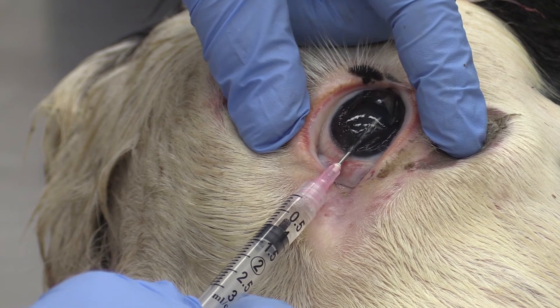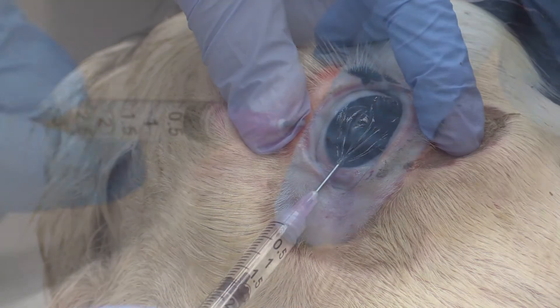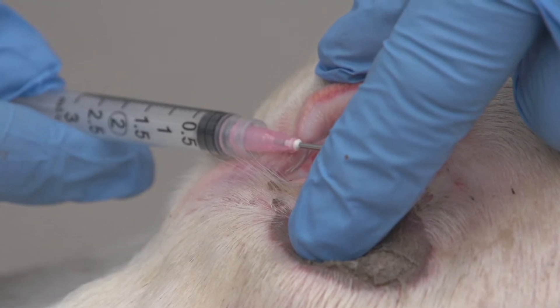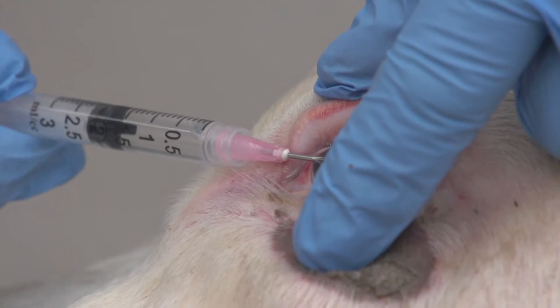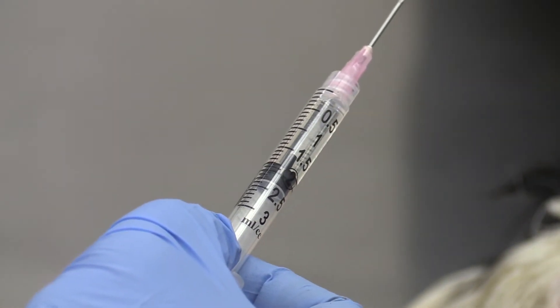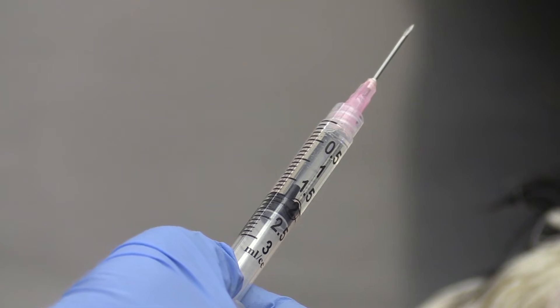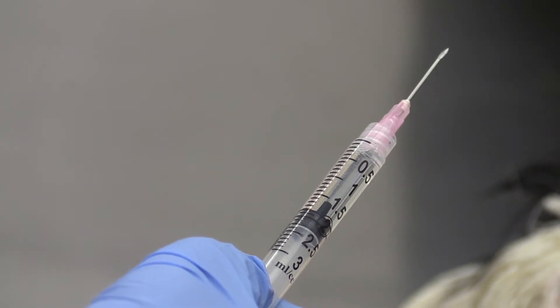With negative pressure, draw out 1-2 ml of aqueous fluid. Both eyes can be sampled and mixed if necessary to obtain the 1-2 ml. Keeping the bevel up helps eliminate solid structures like the iris from blocking the needle opening and contaminating your sample.